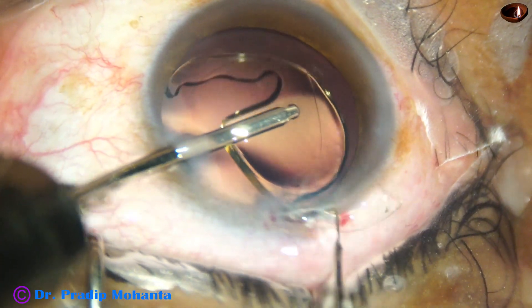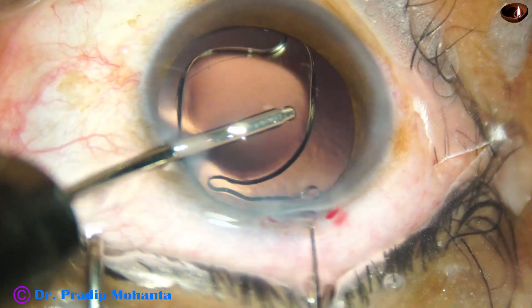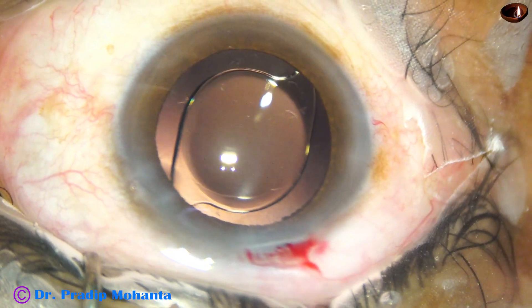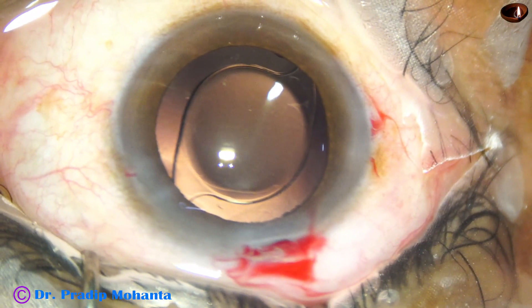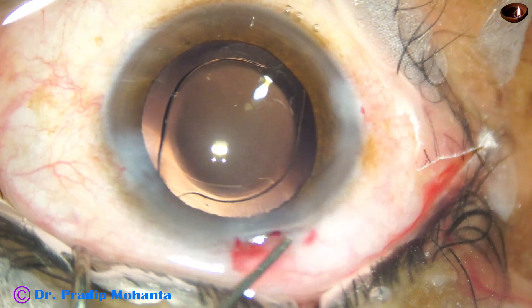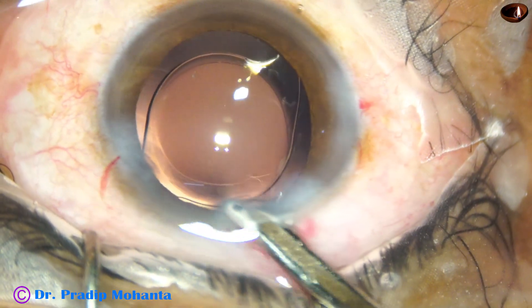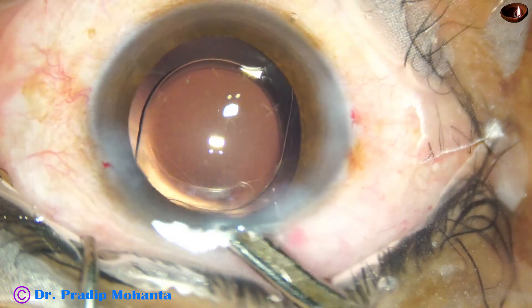This is a Szynski hook which pushes the trailing haptic into the anterior chamber. He takes the Szynski hook, dials the trailing haptic into the capsular bag. And now he hydrates the side ports. The main wound has also been hydrated on one side.